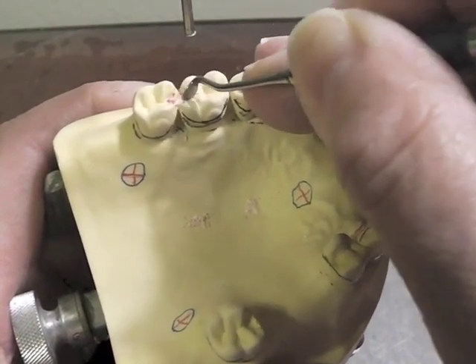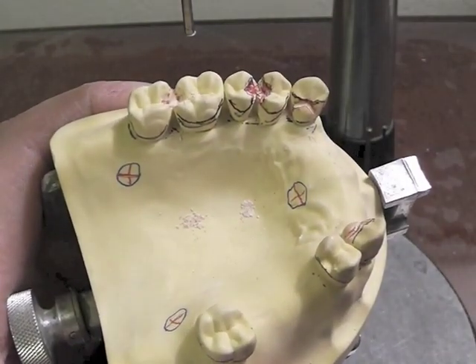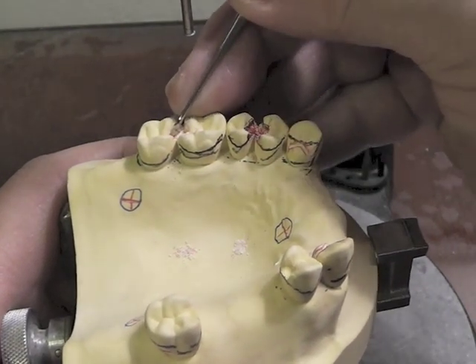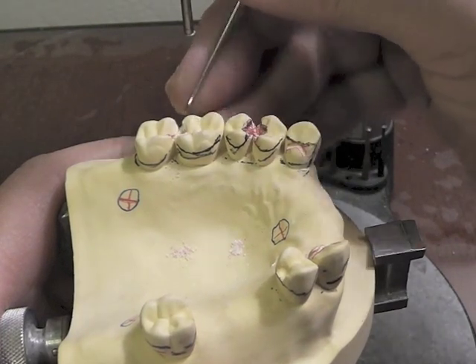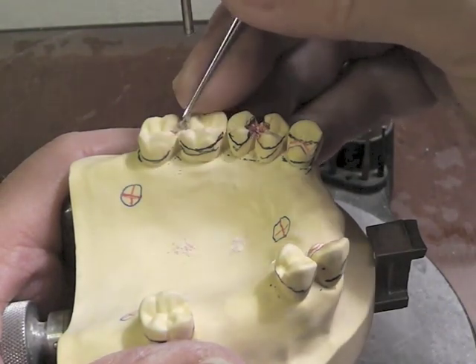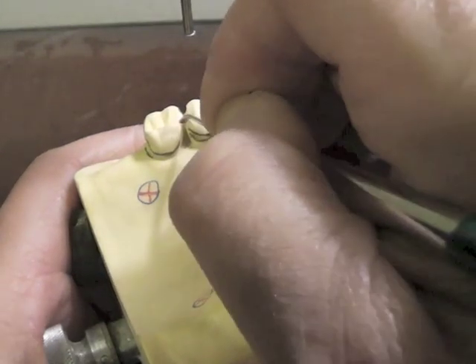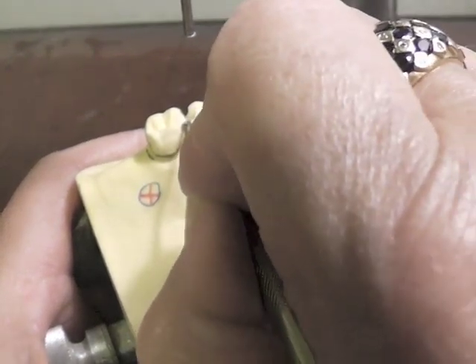We don't want to go through into the dentin — it's very uncomfortable for the patient. We have to have a couple of sluice ways in this area, and I usually will come through with a round diamond and bring it right through that embrasure area, taking a little bit off of both teeth so that I don't have one that looks lopsided. I'm trying to make room for metal to come through here with an arm without disrupting the occlusion. If I don't take enough off, you may end up having to adjust the occlusion and end up with an arm that breaks off. So I've got to have metal coming up over that hump that's in occlusion, and I have to make room for that with a sluice way.